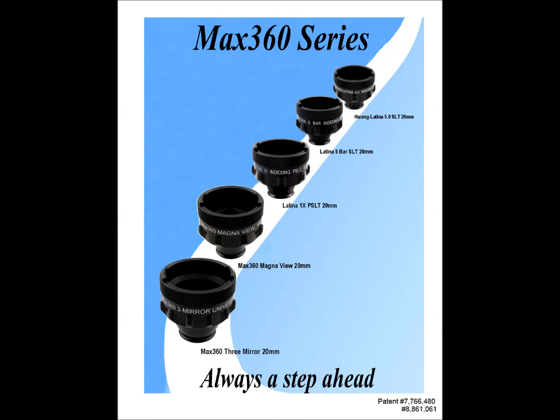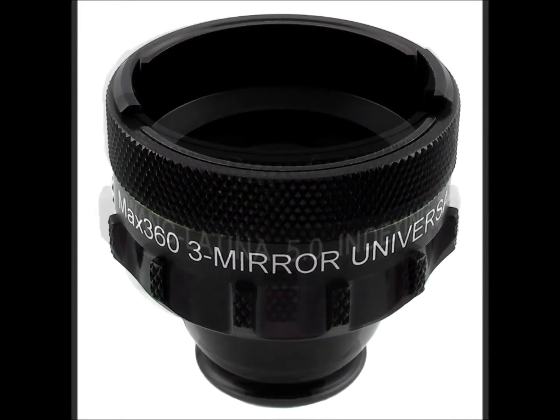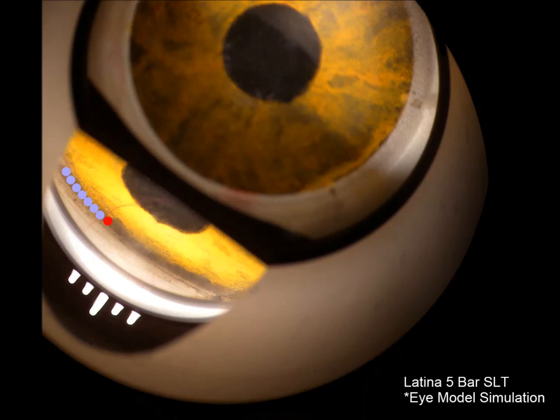Look for the MAX 360 rotating feature on many of our popular prism contact lenses, including the three-mirror lenses and the MagnaView lenses. This feature enhances the PLT and SLT lenses, including the Latina and Wang designs, where the indexing stop works in concert with internal reference figures that aid in laser spot placement.